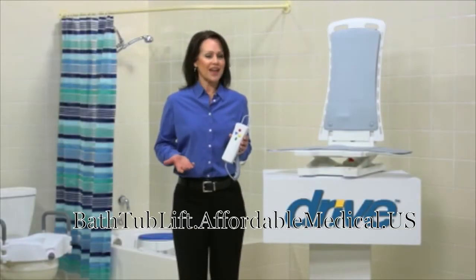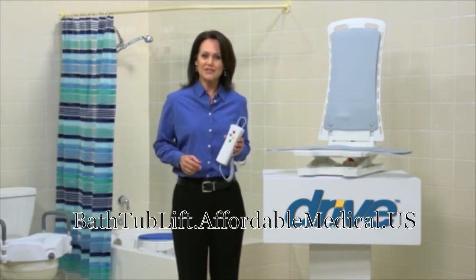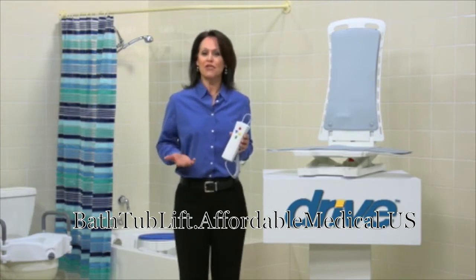Taking a warm bath is one of life's simple pleasures. A bath can relax sore muscles, relieve stress, and even help improve your circulation. To ensure your safety while you enjoy all the benefits a bath can offer, Drive Medical offers their innovative Bella Vita auto bath lifter.